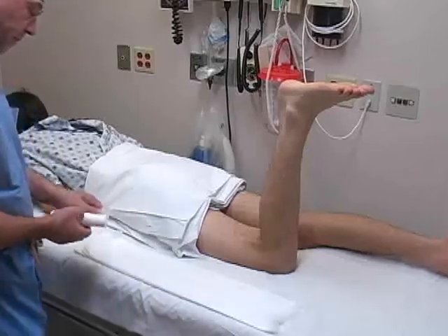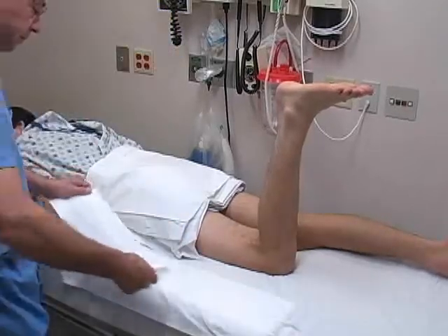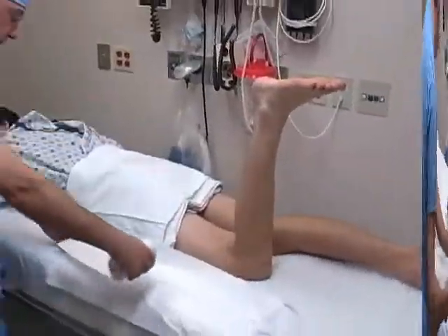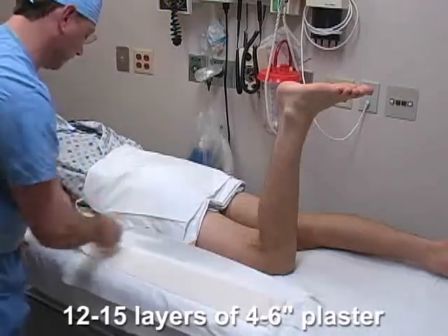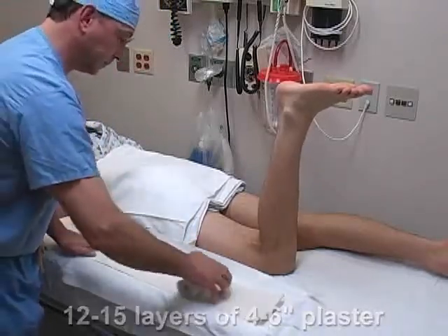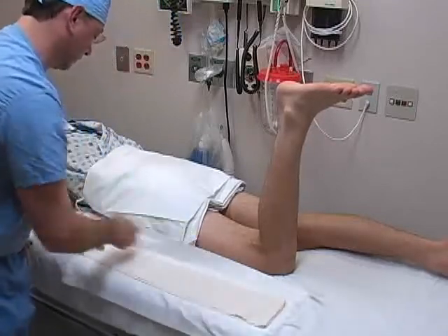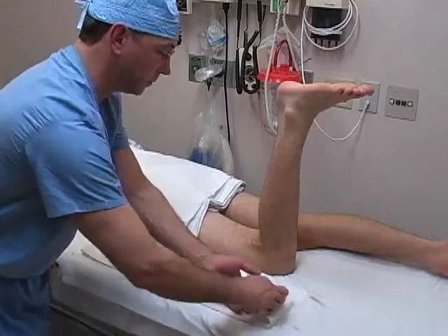Use two pieces of webrill to make the top layer, each offset from the previous layers by 50%. Next, roll out 12 to 15 layers of 4- or 6-inch plaster on top of the webrill. The plaster may be folded back and forth upon itself during this process. Several rolls of plaster may be required for the short leg splint.